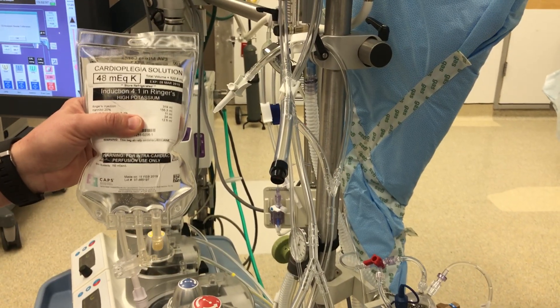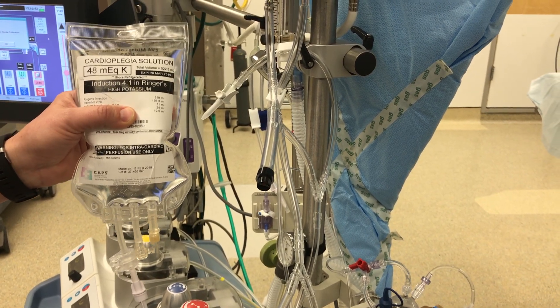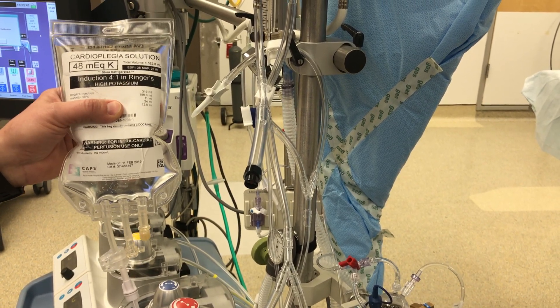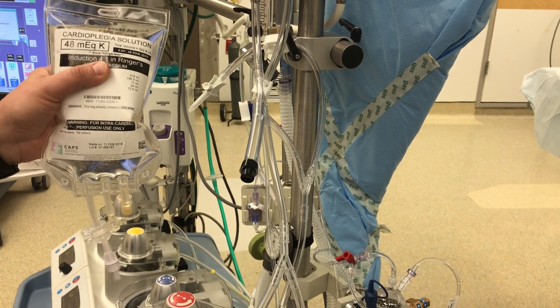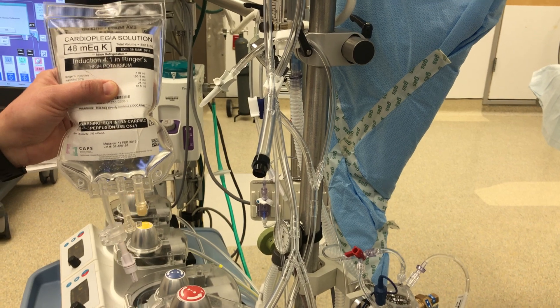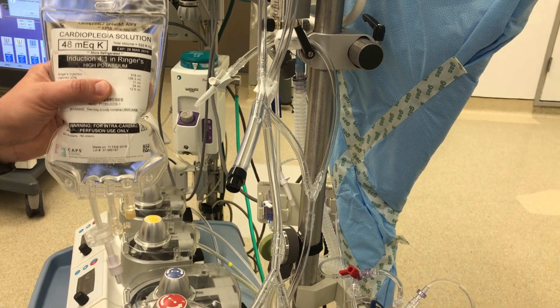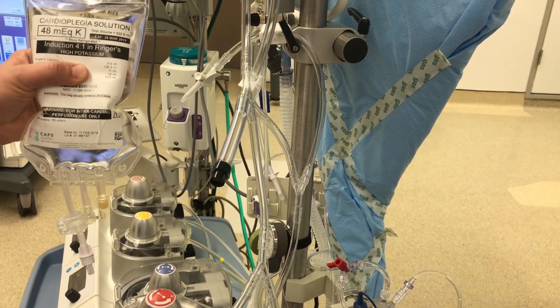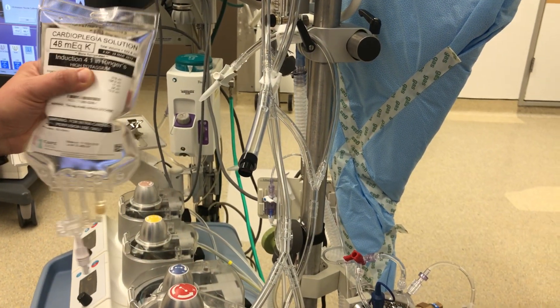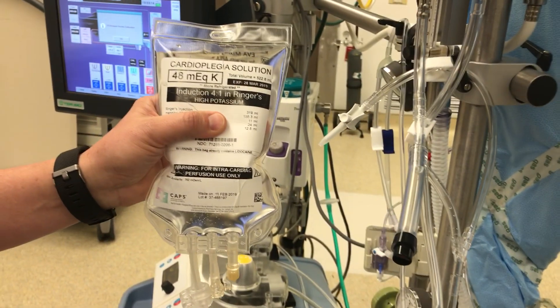People forget that the heart is an electrical device, and with enough potassium the heart will depolarize and fail to beat. This lets the surgeon work on it at their own pace and keeps the heart safe and quiet. As this will only last for a certain amount of time, we'll give subsequent doses that will clear out all the bad metabolites and re-infuse a new volume of oxygenated blood with cardioplegia. The first dose has a high potassium to stop the heart, and subsequent doses will have about one-fourth the amount of potassium to keep the heart quiet and comfortable.